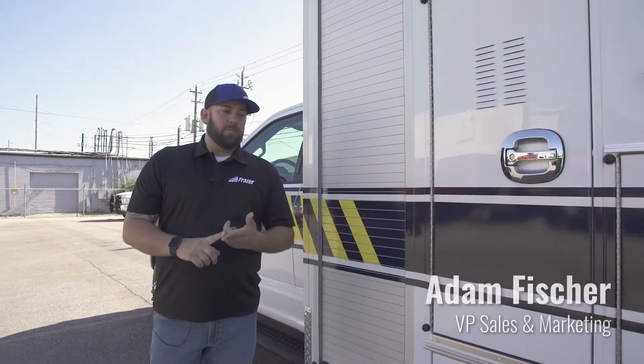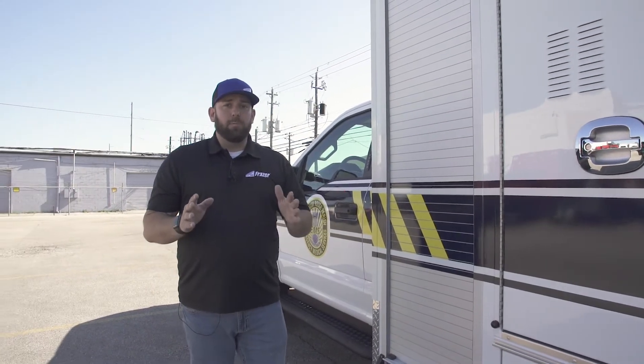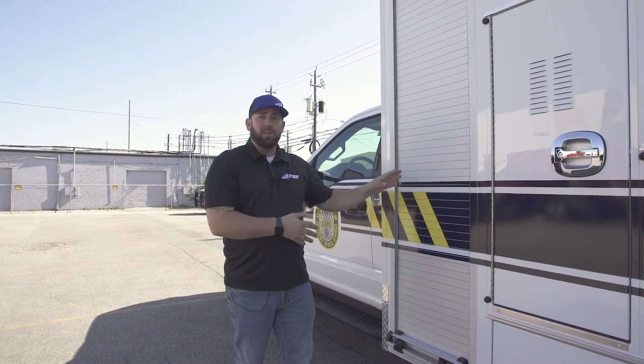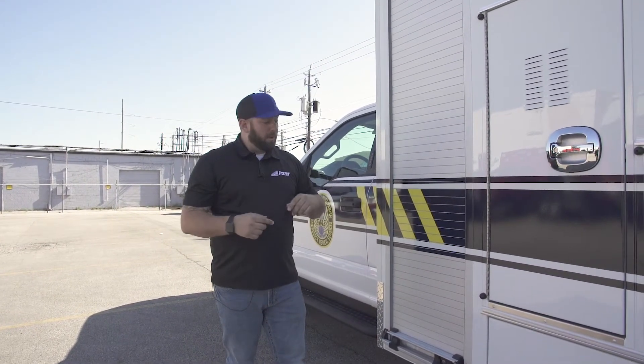Welcome to the how-to video of the Bariatric Transsafe Winch System. Where you have the equipment — the winch and the ramp — stored on your vehicle or on another vehicle is going to be up to you. This is a transverse unit with storage space dedicated for it, so I'm going to show you what we recommend and how we recommend to use this space to install the equipment.